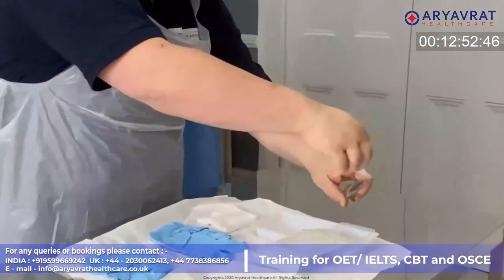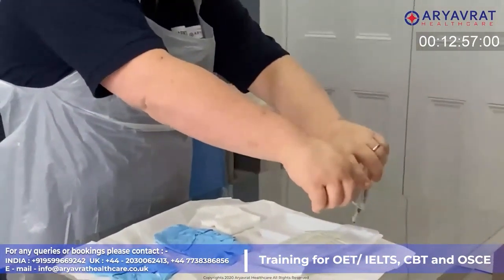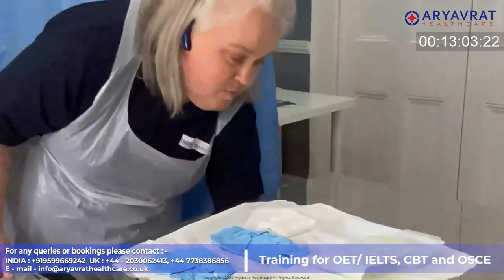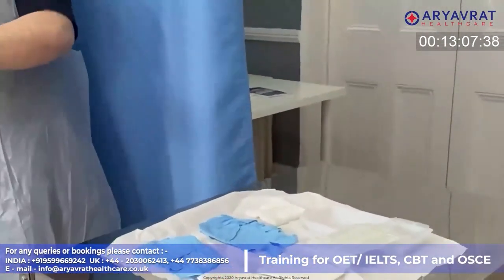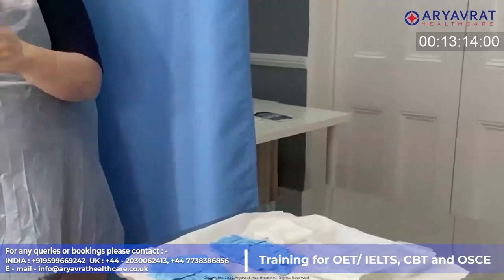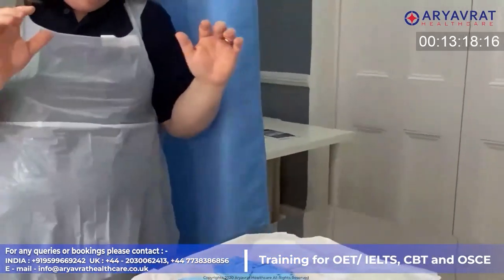And carefully, I'm going to open it and pour into my pot, making sure not to make any spillages. And now I'm ready to proceed. So hand hygiene one more time. Okay, making sure that my hands are completely dry.